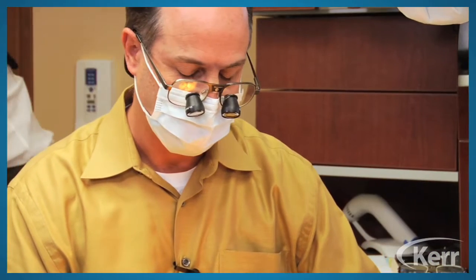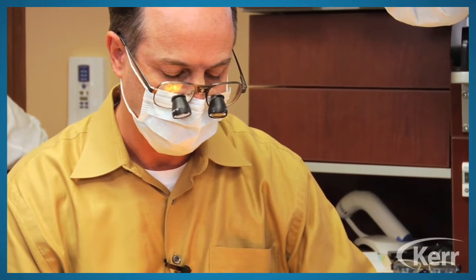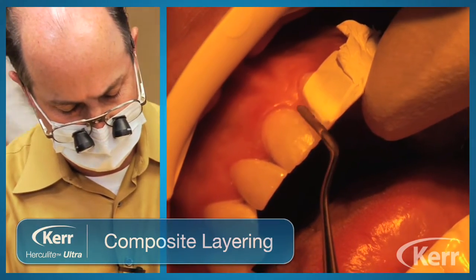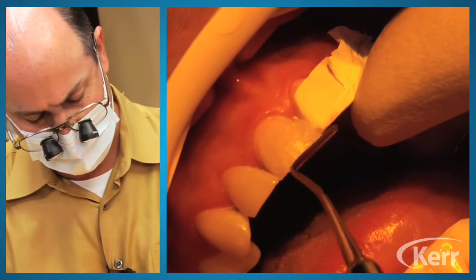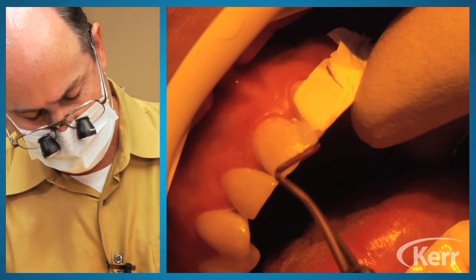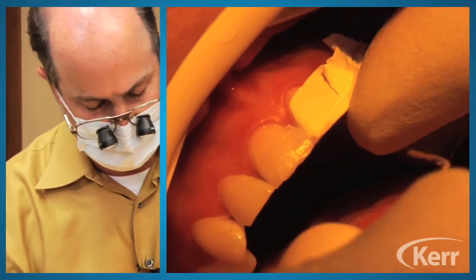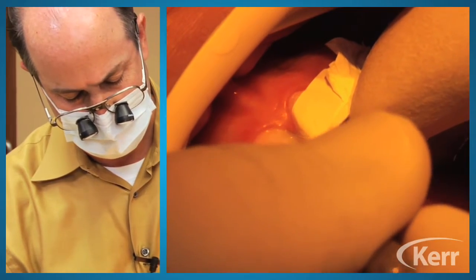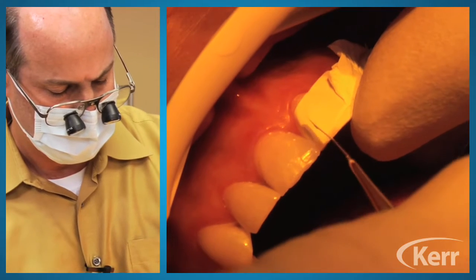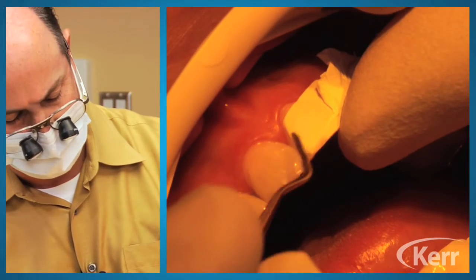And now I'm going to use just a little bit of the incisal light shade, just the smallest amount here of a second layer. As I said, I probably could have gotten away with it really with one shade, and that really was the design of the Herculite Ultra material, to try to keep simplicity. They've cut down on the number of shades in the system versus the Herculite XRV, so trying to simplify the shades, don't make it so complicated, but still cover your basic shades that you need when you're doing your direct composites.